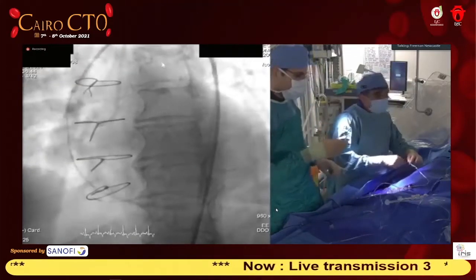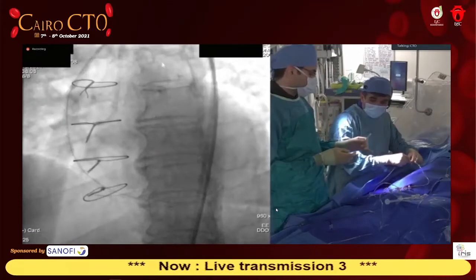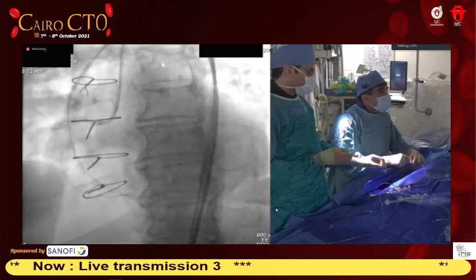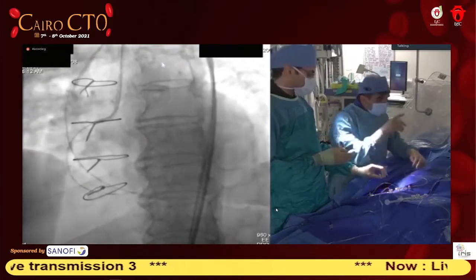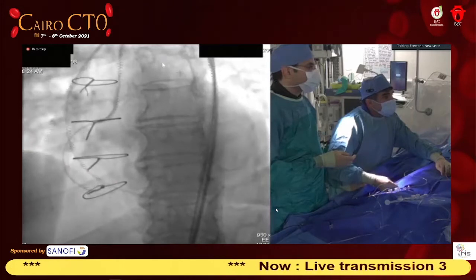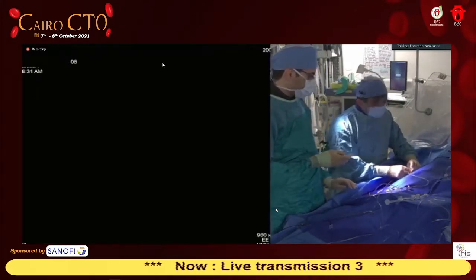And when you're doing that, when you come close to the both microcatheters, you really have to make sure the manufacturers should do some innovation in this. I mean, they should do something about it, the RG3. So here's the antegrade catheter. I said you need to keep them apart. So I am going to pull this back. In a smaller artery, they could interact, and the tip of the antegrade and the retrograde can become entangled.